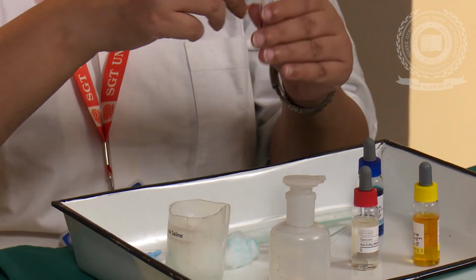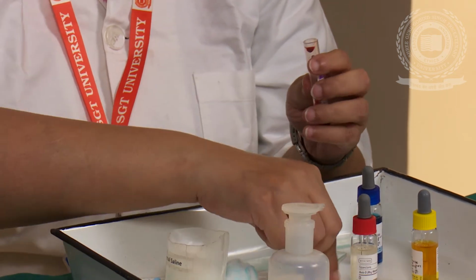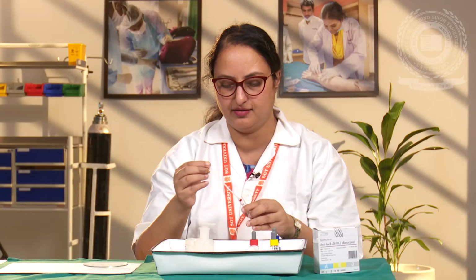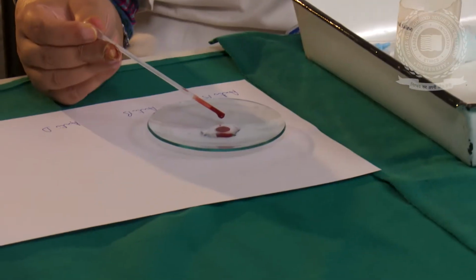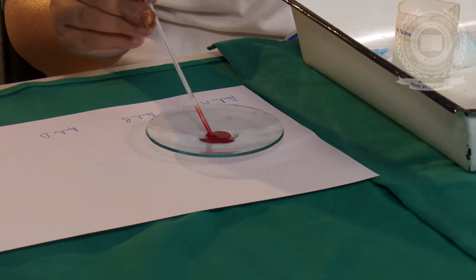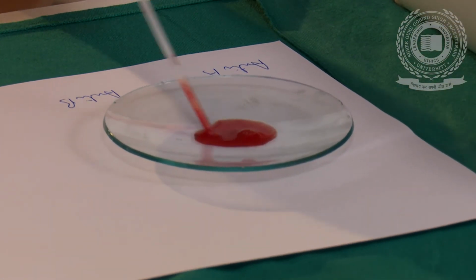For the purpose of demonstration, I will be using blood in this vial. Like this, I have to take 1 or 2 drops of blood in the saline solution. And mix it. This forms a blood saline suspension.